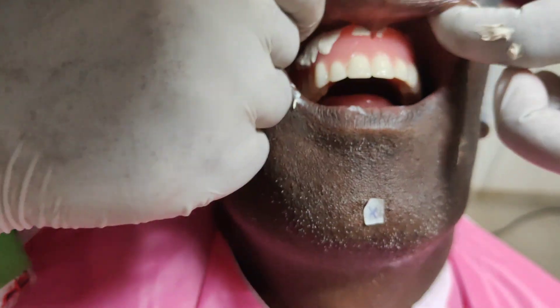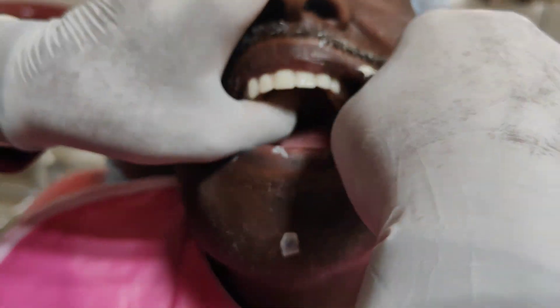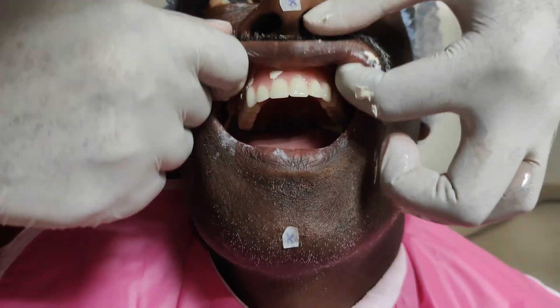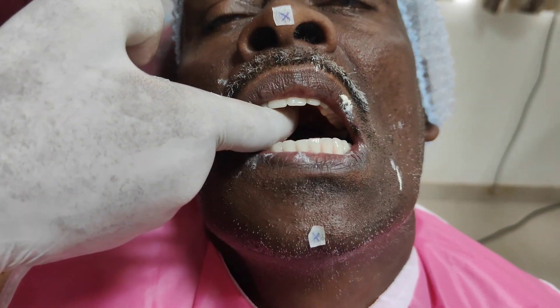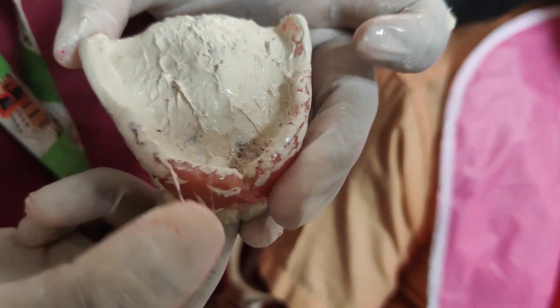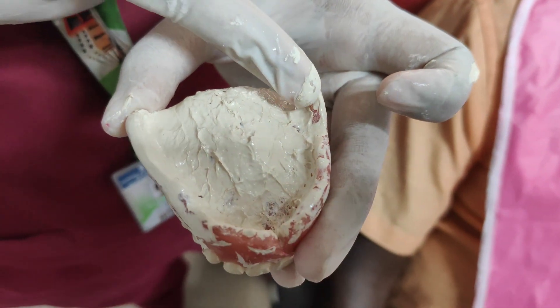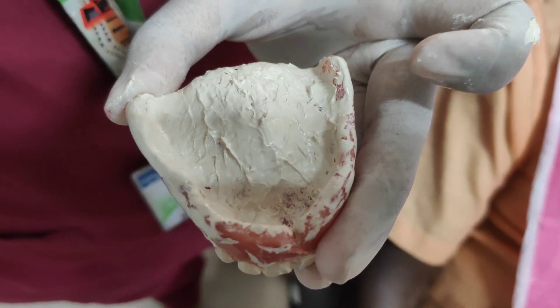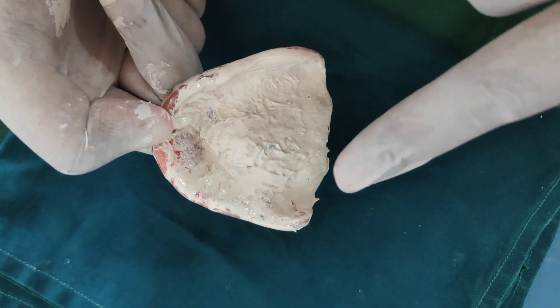All functional movements are performed similarly to border molding. After performing all the border movements for the maxillary denture, the denture is removed from the patient's mouth and examined for any nodules, overextension, or pressure spots. A pressure spot is found to be present on the denture in this region.